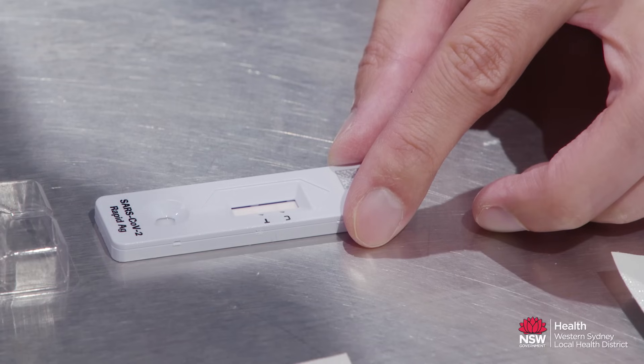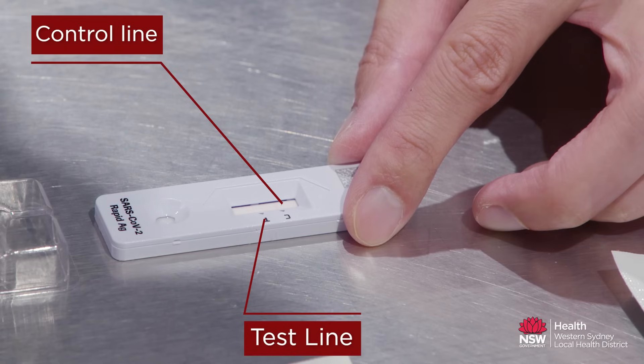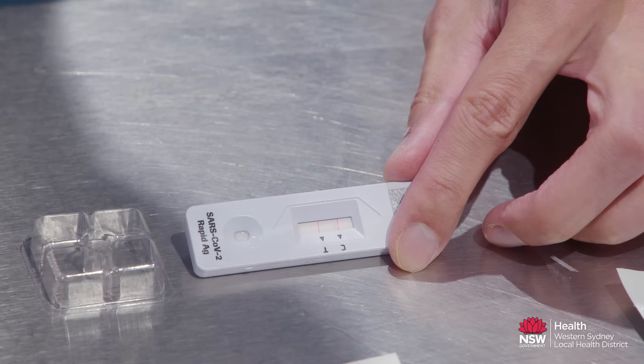There are two lines on the test device: one marked C for the control line and one marked T for the test line. If a control line is not visible, the result must be considered invalid. If a test line is visible together with a control line, this means that the result is positive.